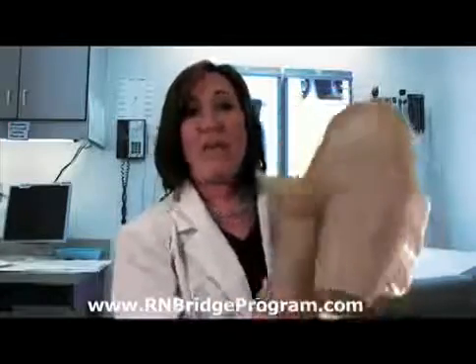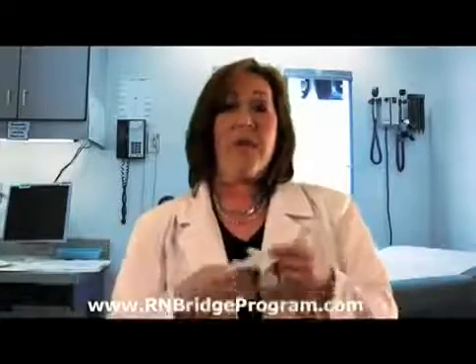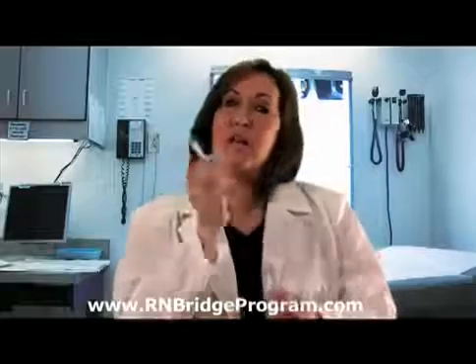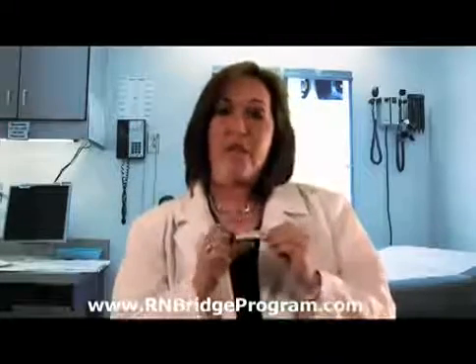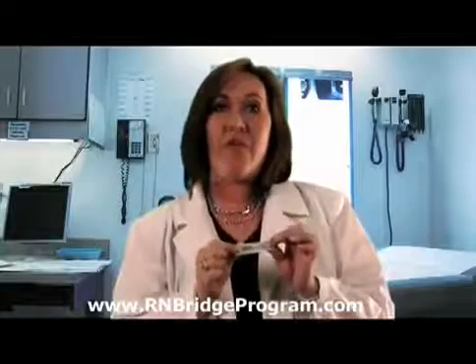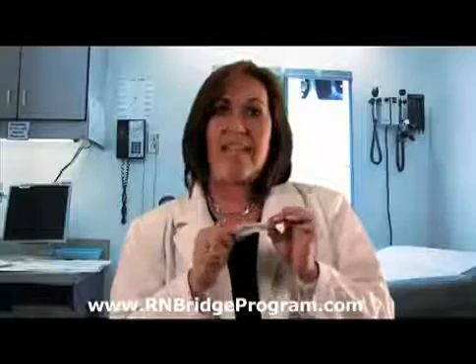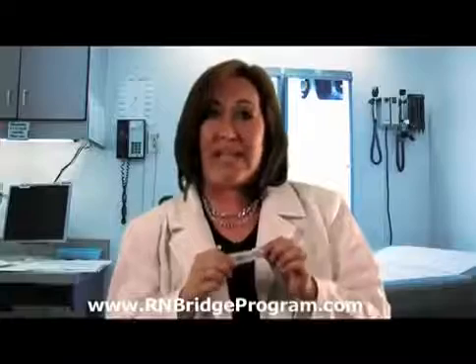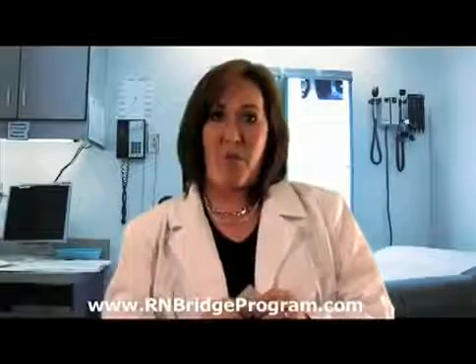Now let's talk about some of the supplies that you're going to need when you're getting ready for this procedure. You need a pair of non-sterile gloves. We're not doing a sterile procedure, so non-sterile is absolutely fine. You also need your syringe with your medication, and then you need a 1.5 inch long needle. We do a 1.5 inch so we get deep into that muscle because it is an intramuscular injection, so we don't want to actually get into the subcutaneous tissue. We need deep into the muscle, and the 1.5 inch is the most appropriate for this site. And then you need your alcohol swab.